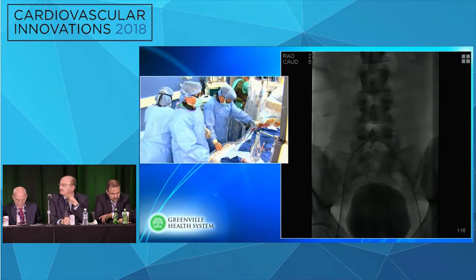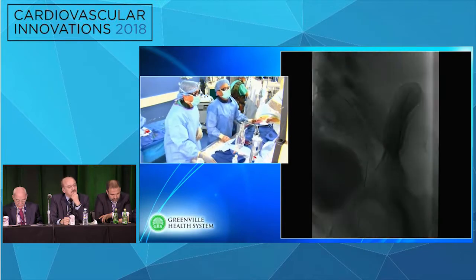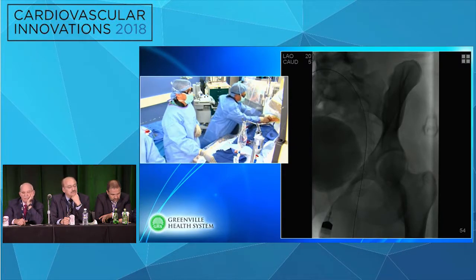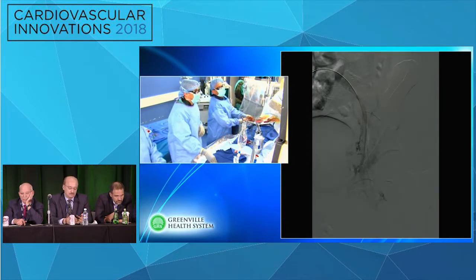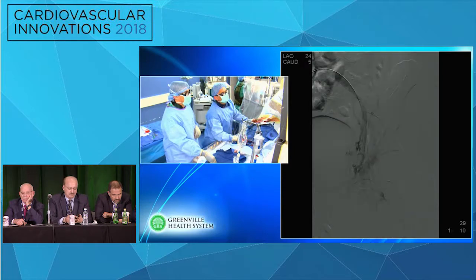So that's the next question, starting on this side now. Tony, landing in the profunda, or that little nub of the common femoral to start with? Or first do common femoral, and if you see collateral filling, then take it lower down and put an additional stent distally. Well, you could do it that way. I think you're going to learn a lot by this initial injection right here. It looks like the common femoral is not completely normal, so I think you're going to have to take it down a little further. Steve, quickly? I would definitely take it, I'd be very aggressive, well below the inguinal ligament.